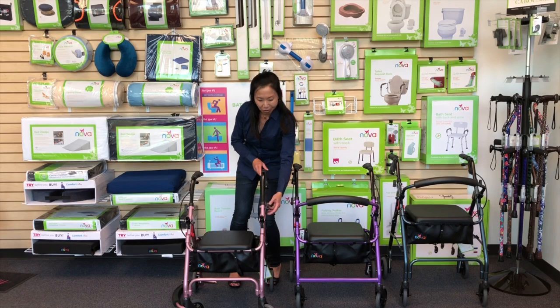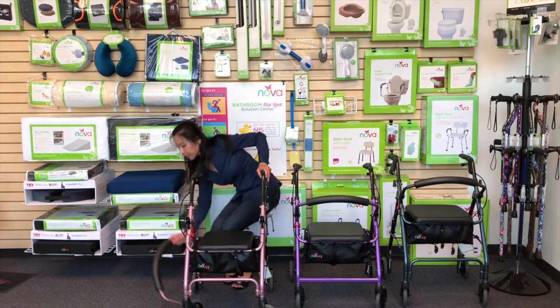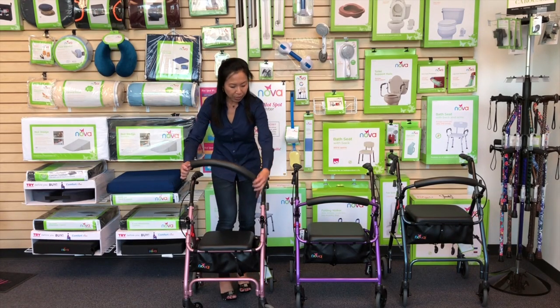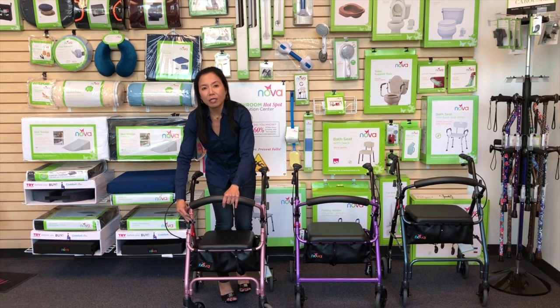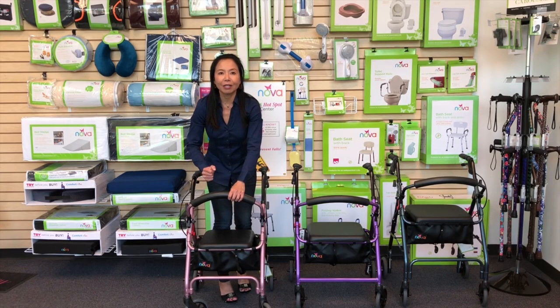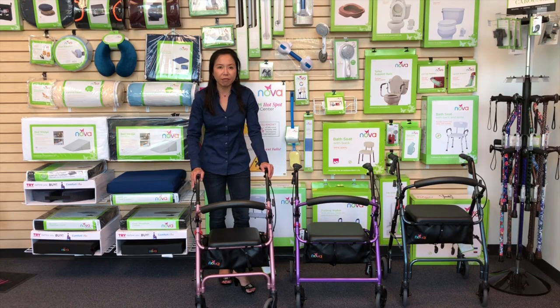All right, now your handles are installed into your height. Now let's put on the backrest. So on your backrest, you'll notice these brass buttons, face them upward. Go ahead and insert the backrest into the holder. Give those brass buttons a push. Push the backrest in, and it'll lock right in place. It's really simple.